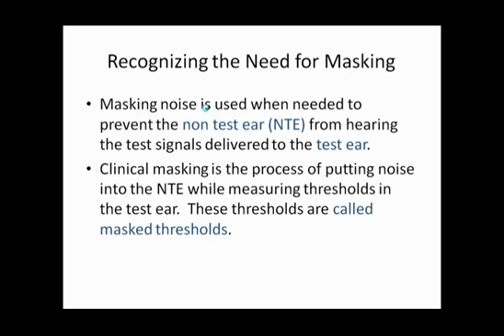But a pure tone audiogram, bone conduction and air conduction, when you need to do a lot of masking, when there's always the risk that the non-test ear is hearing the tones, that could take you 2 hours or even more. And then if the patient's responses are not reliable, oh my gosh, 3 hours? That's just for pure tone thresholds. That does not include otoacoustic emissions.